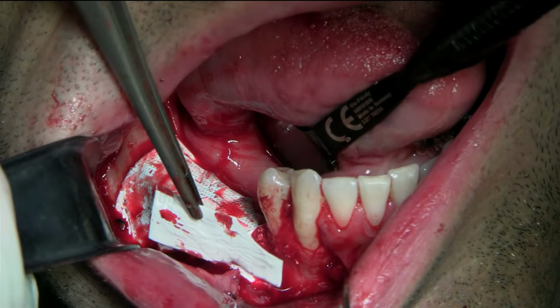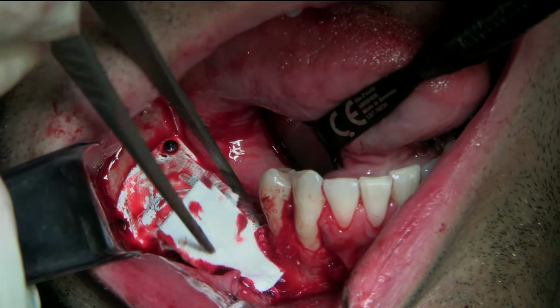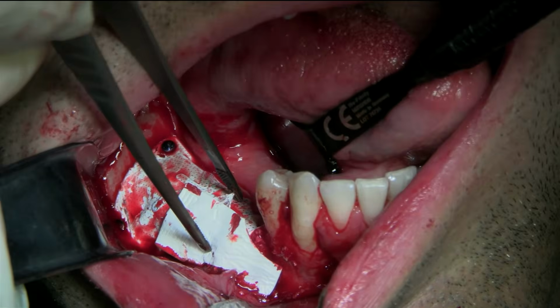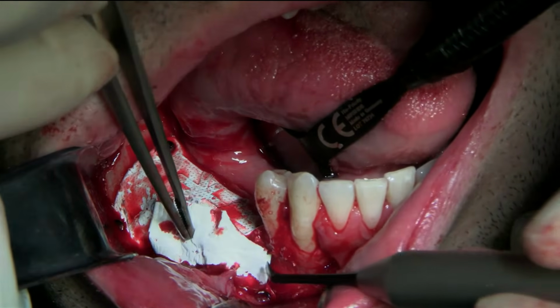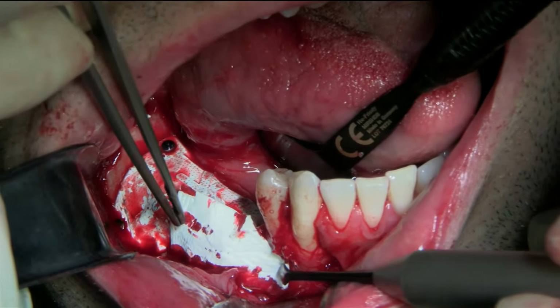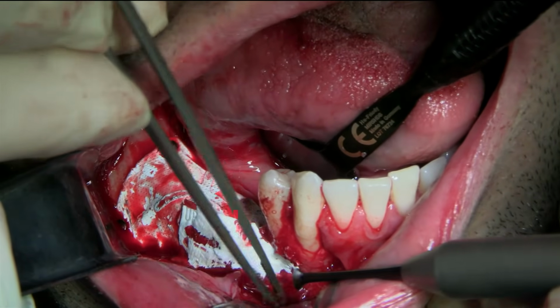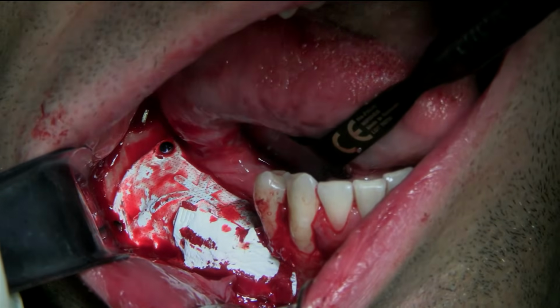So that's the BioGuide. It's about 1/2 millimeter thick, this one. The other ones are a little bit thinner. Thickness gives us also a little bit more stability. So it hydrates right away.